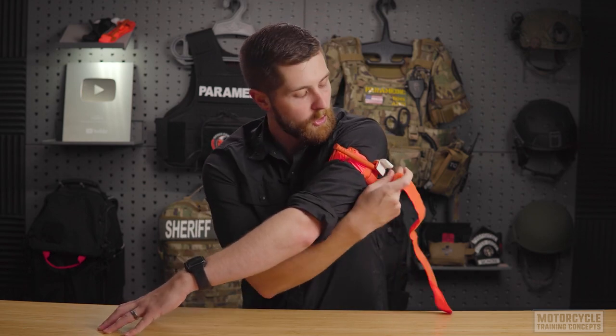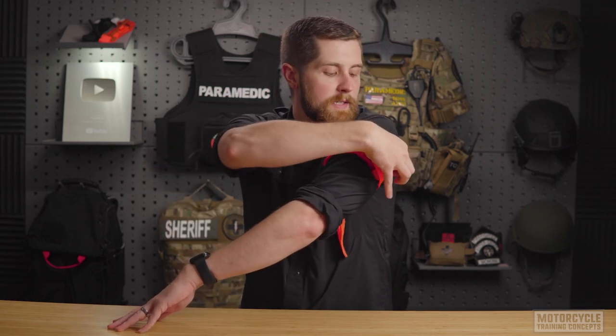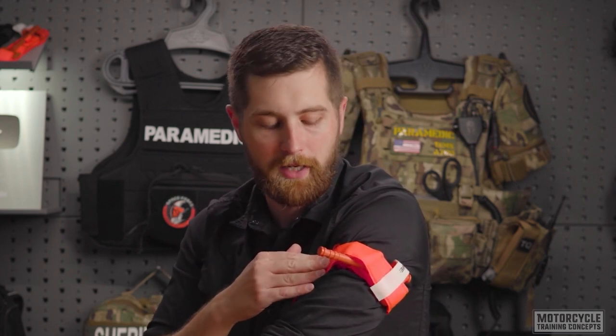I'm going to take the tail of this tourniquet that I let drop a second ago, feed it over, take the time strip, and put it over. If you're in the mindset to do so, you can write the time of application to help the emergency room identify if it's safe to take off, or if they need to provide medications to the patient prior to removing the tourniquet.